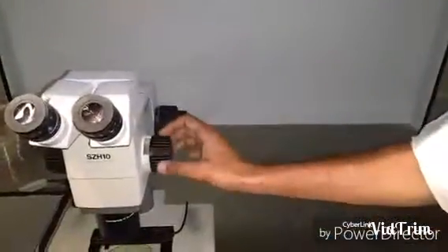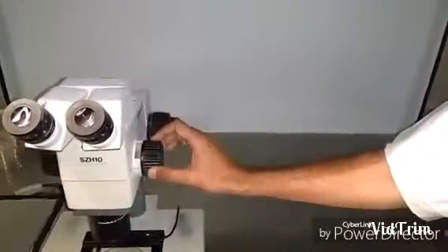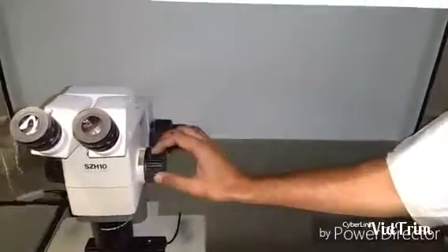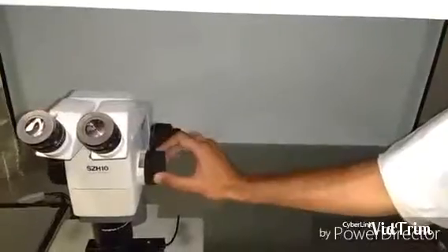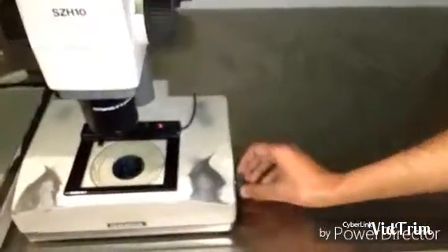We can adjust the zoom as well. We can zoom it to 4x, which is 4 times, using this knob. One has to rotate it clockwise in order to zoom. We can also adjust the contrast of the vision using this knob here.